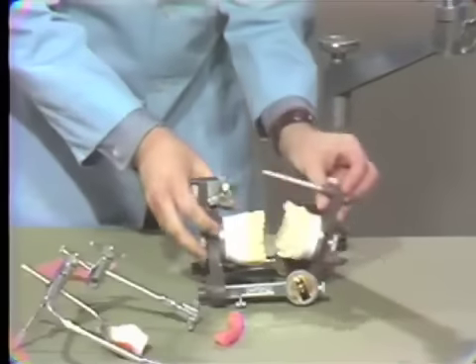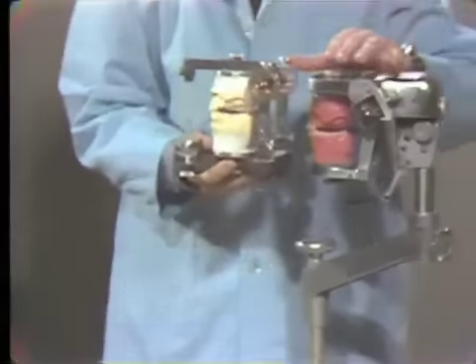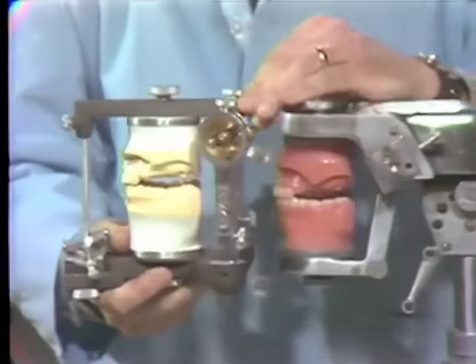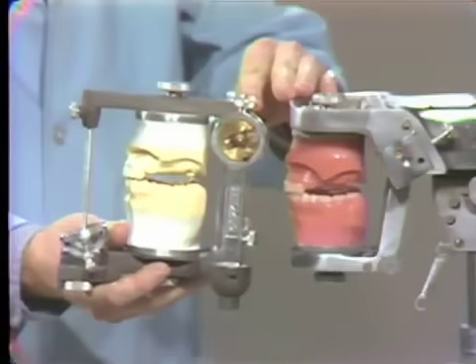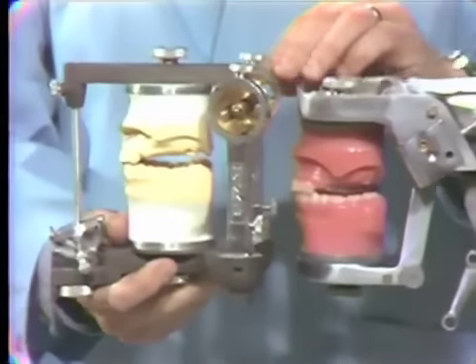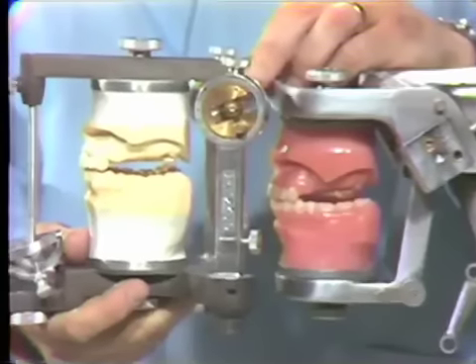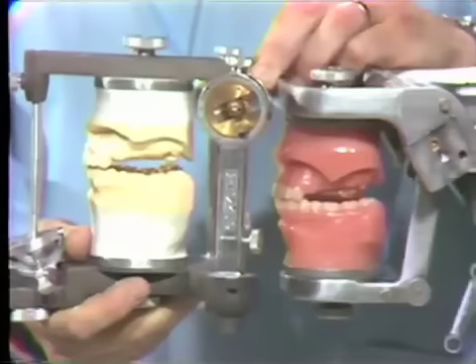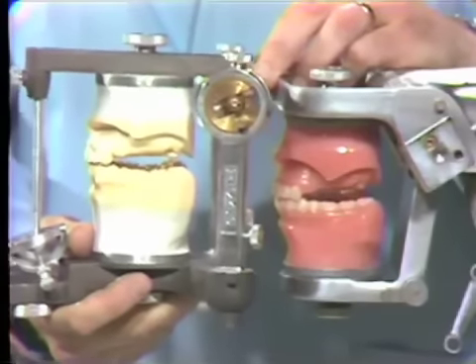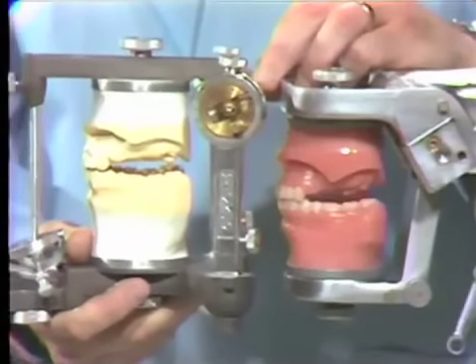The last step is to go back to the mannequin and observe the relationship of your mounting to the mounting on the mannequin. Just by observation you should be able to tell whether it's correct — check the horizontal plane of the maxillary cast and the relationship of the anterior teeth to each other. At this point you are ready to set the teeth on the maxillary immediate denture, then wax the denture, and that completes the exercise for the immediate denture.